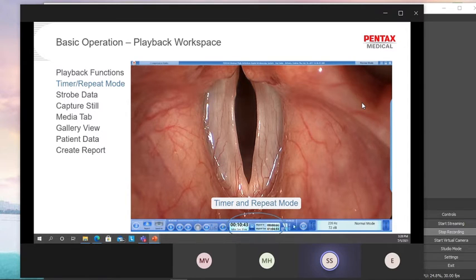Then if you do a play, the loop will be looping between the repeat in and out, which means they won't play from end to end. They'll only be playing the loop that you selected. So repeat in, you select at maybe 5 minutes, and repeat out at 20 minutes, and you'll keep looping right here. Is it okay, Emma?